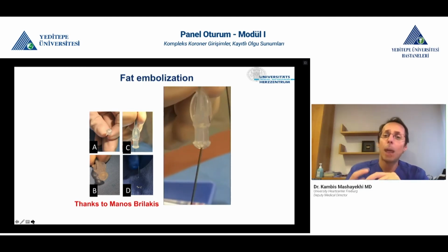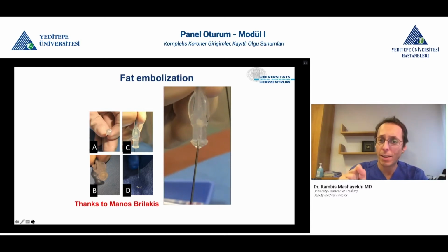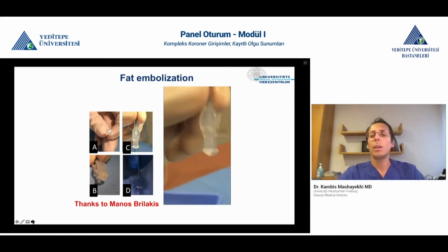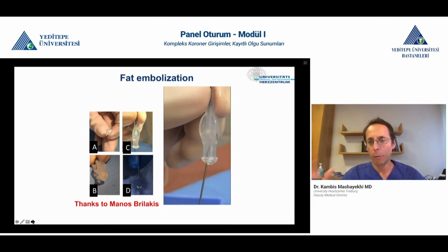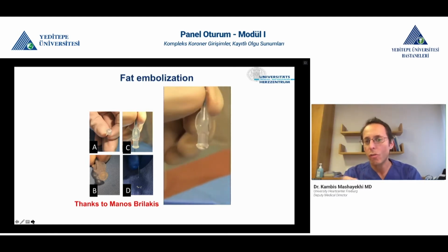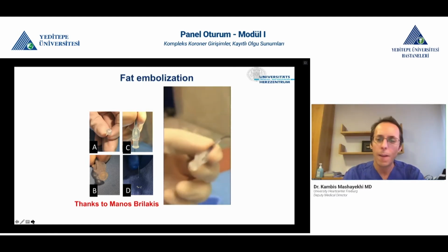But then I would recommend not to flush the fat in, because whenever you flush in a destroyed channel, you will blow up even the perforation. So therefore, after the fat is in the microcatheter, use a wire to try to bring the fat down. Actually, it's not so well controllable as the coils. The coils are really clear.